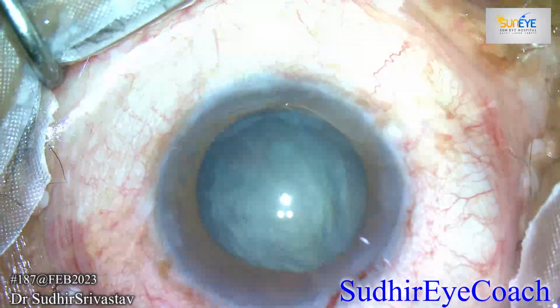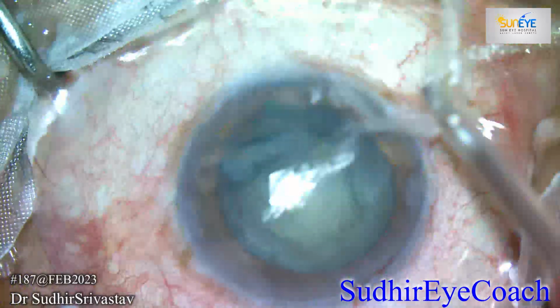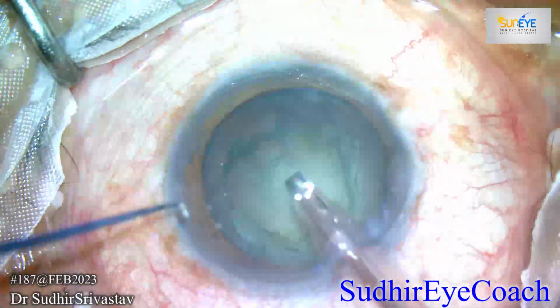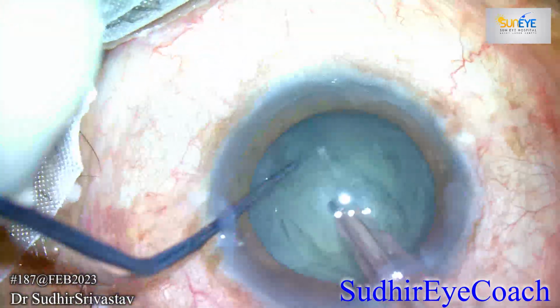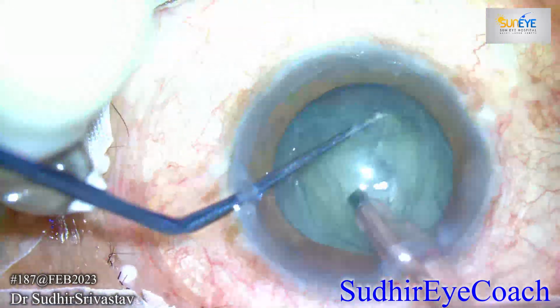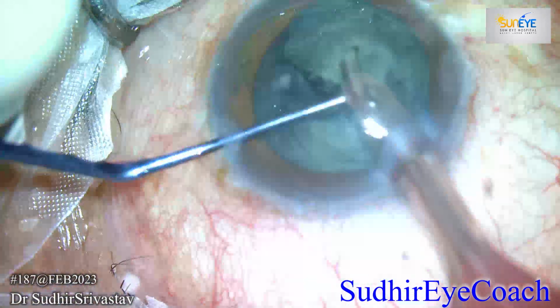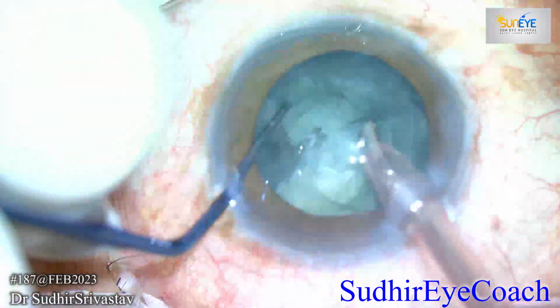At this stage, everything was appearing normal and the nucleus was hardly grade 3, grade 4. Everything was going fine and it was a normal appearing cataract. I started phaco-fragmentation. Normally I do vertical chop. I held the nucleus and divided the nucleus in two pieces, then gradually picked up pieces and started phaco-fragmentation.